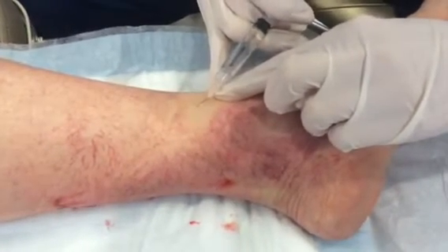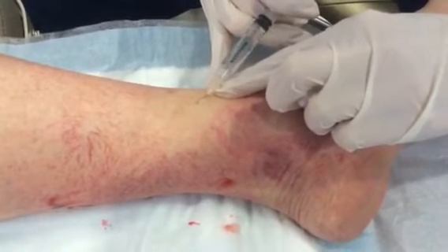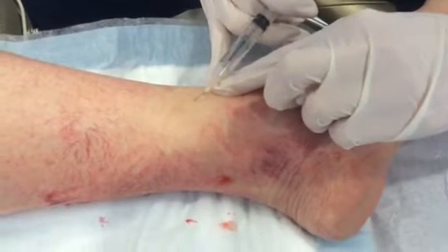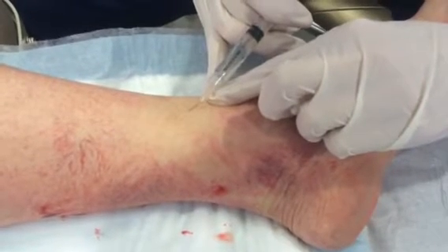This feels a little crampy to the patient, but you can see with one tiny little poke we're getting this entire area. The reason I like glycerin is there's much less chance of side effects — things like pigmentation, ulceration.